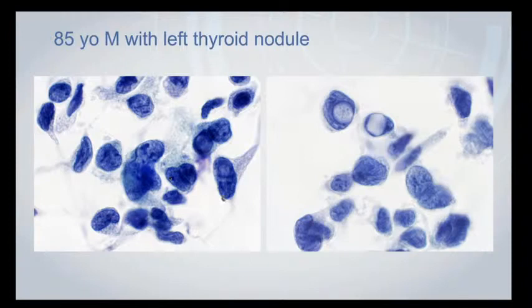There is a so-called pleomorphic variant of a medullary carcinoma, and it might make you think about anaplastic carcinoma. They're not usually as pleomorphic as the standard anaplastic carcinoma, but they get pretty close. And again, another suggestion I would make to you is before you actually call something anaplastic carcinoma, just do a calcitonin. If it's positive, it's probably just an ugly variant of medullary carcinoma.